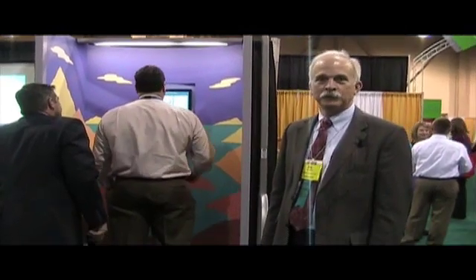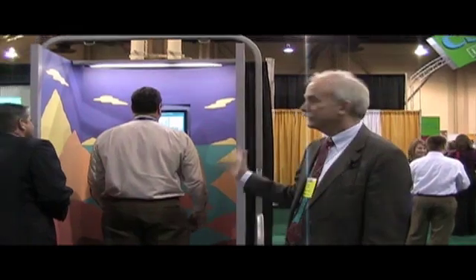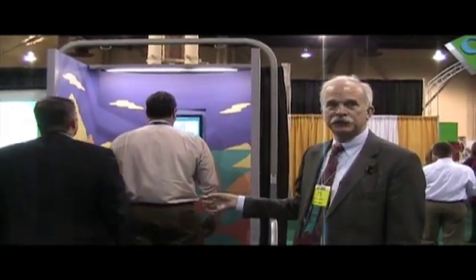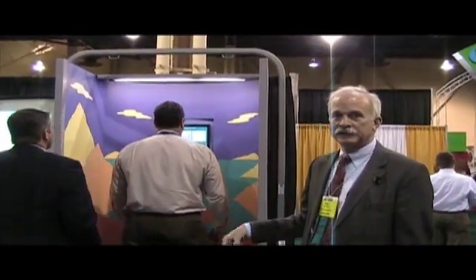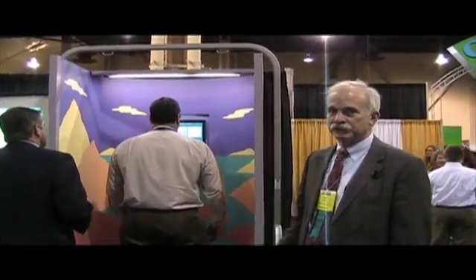I'm Eric Miller from Neurocom International in Portland, and this is the SmartEquitest. This is a system that's used for assessment and treatment for balance disorders.